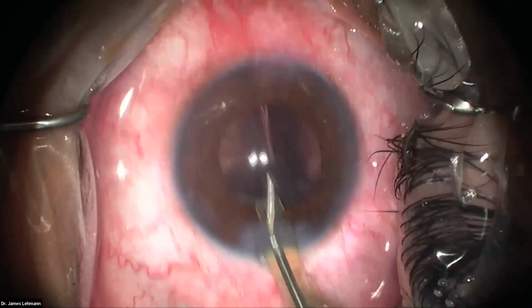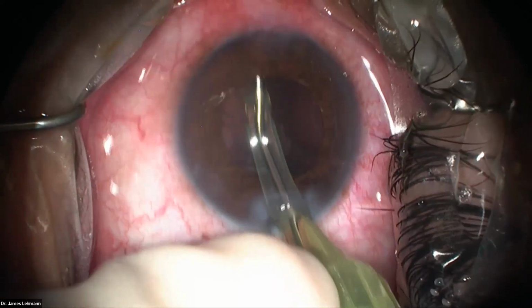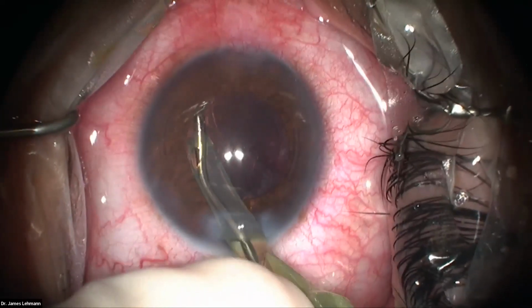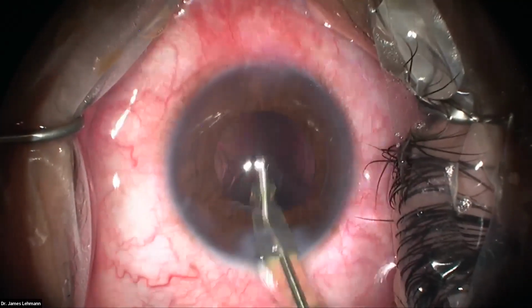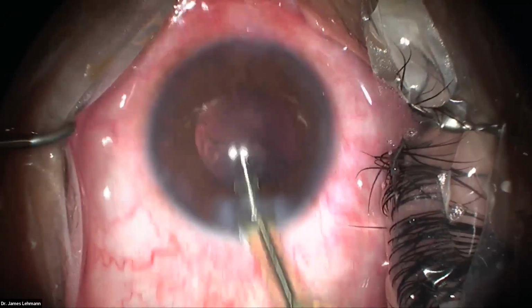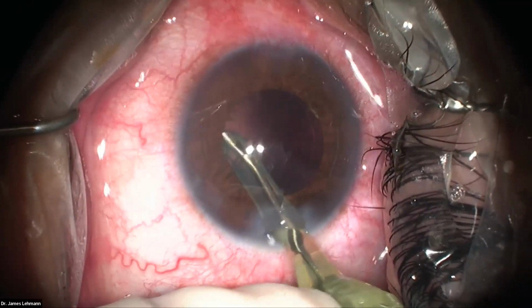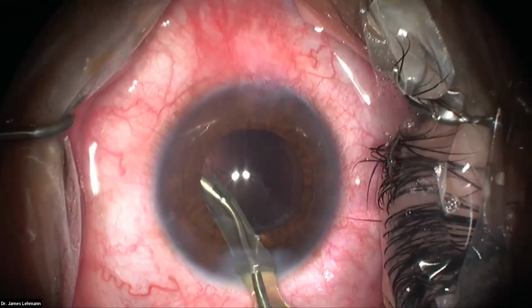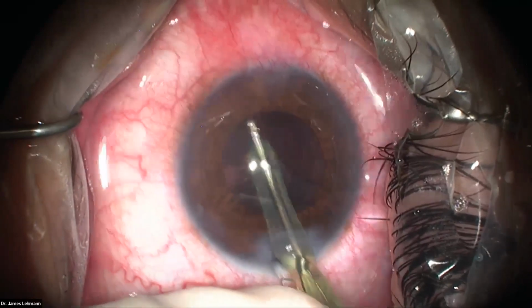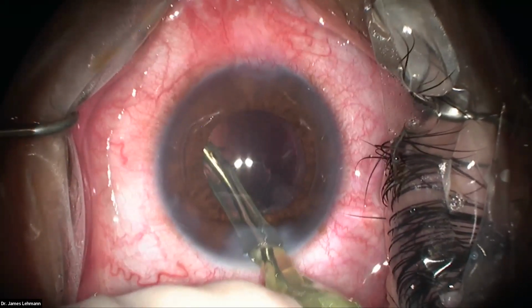Sometimes the cortex comes easy, like in that last case. And sometimes it can be very tenacious and not want to come. Okay. Let's see over here. There we go. Almost there, guys. Getting this last piece. You got any questions you want me to answer, Hunter, while I'm doing this?